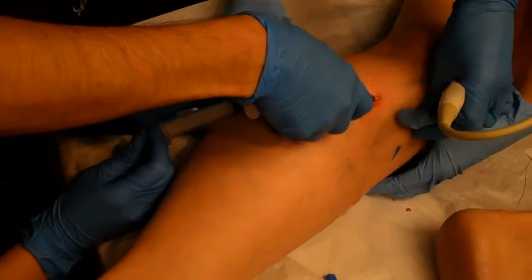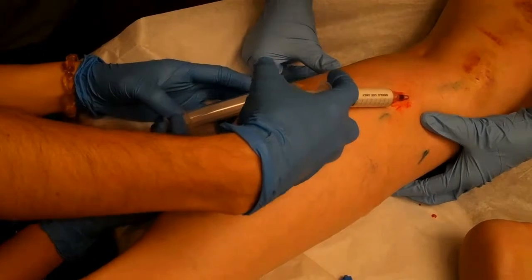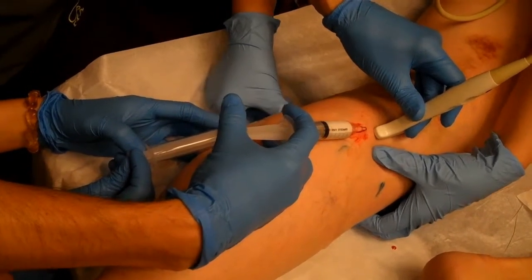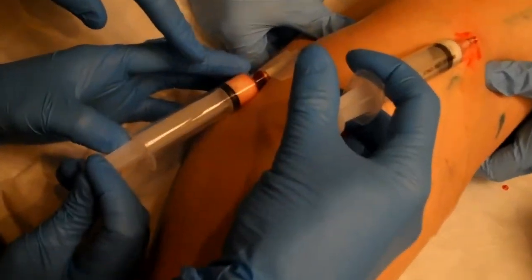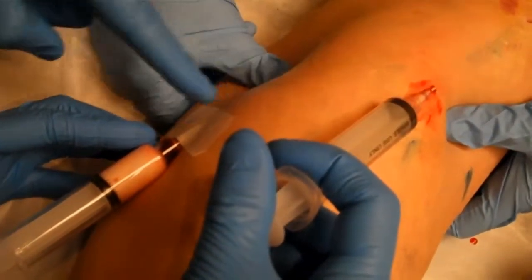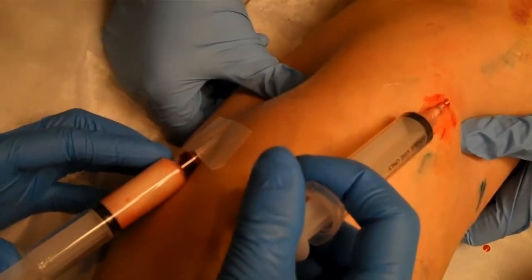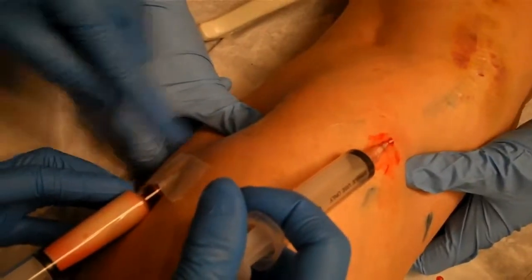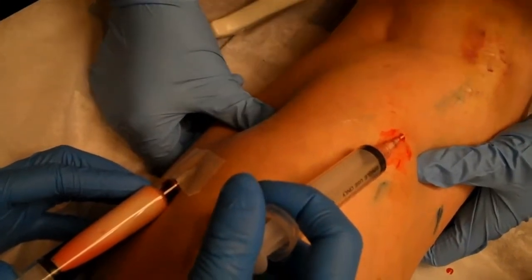A little manual compression here, and the manual compression is ready to block the short saphenous vein. We start doing the foam — see, as I'm injecting, the foam is traveling through that large zigzag vein and doing the endothelial damage, which just needs a few seconds. We don't need to leave foam in the system to close this segment.